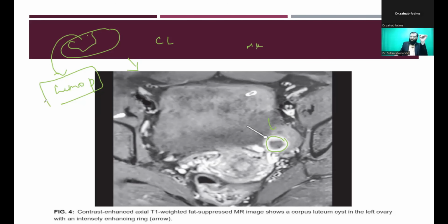That is sufficient to diagnose it as ruptured ectopic. Many times in ectopic, you would just see that the main ectopic pregnancy is not seen, but a big hematoma would be seen in the adnexa, and there is fluid in the POD. If you have just these two things, this is sufficient to diagnose it as ruptured ectopic.